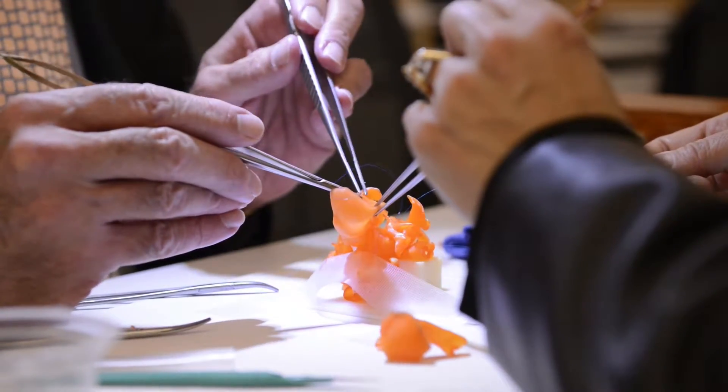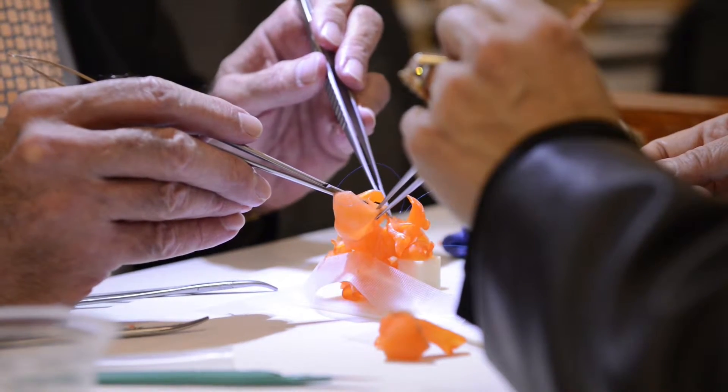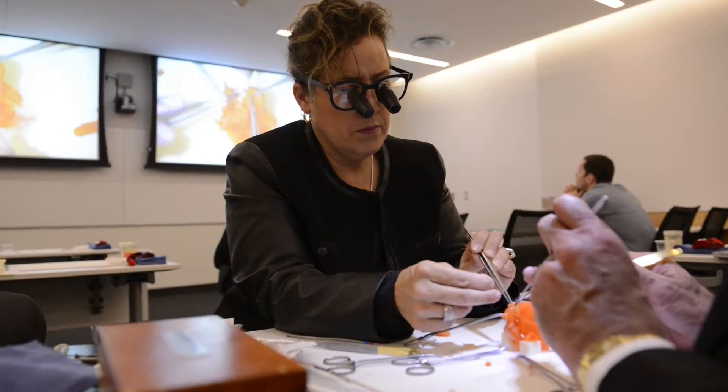Right here is the tip of the cannula. I use the tip of the cannula as the marking point for where it's going. The heart is very small and then the access route is opening — the window — is very, very small too.